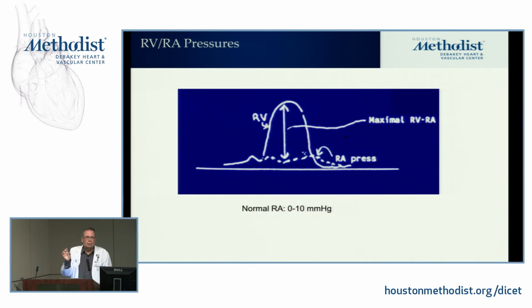tells us the pressure drop, the pressure gradient between two chambers when there is a discrete stenosis, a membrane, not a tunnel. So if you have a membrane, something creating a discrete stenosis in a biological system of the heart, the gradient drop, the pressure drop between those two chambers can be estimated with 4V squared.